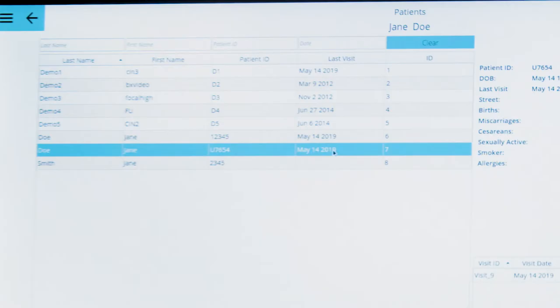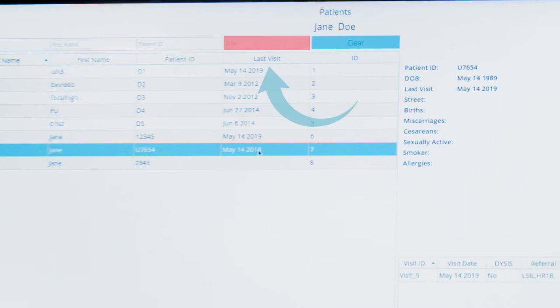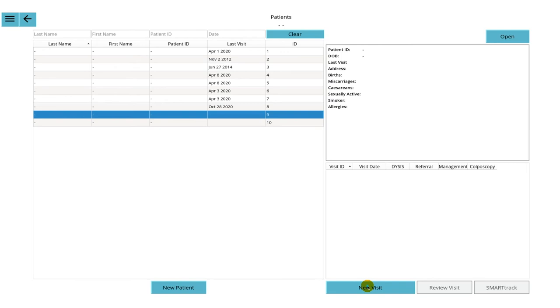A list will appear to select the correct patient. Select New Visit to create a new visit record for that patient. Complete the referral reason and add any additional information.